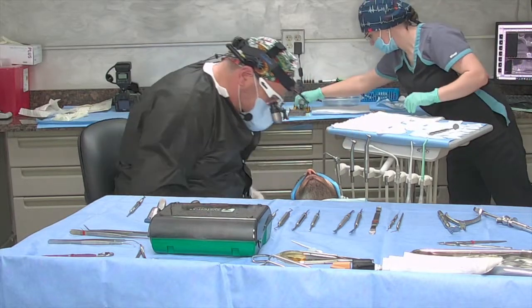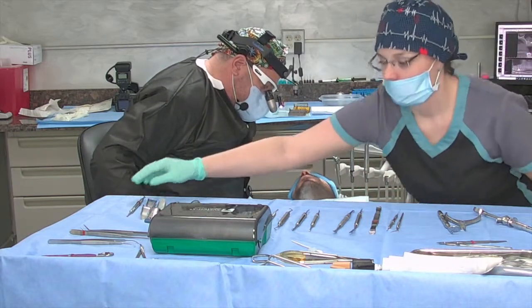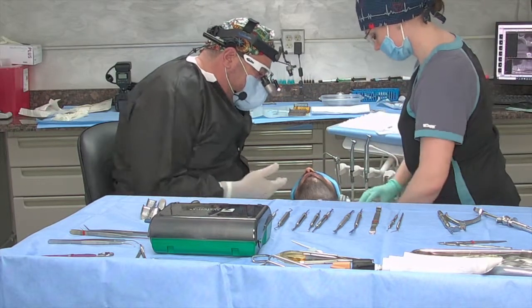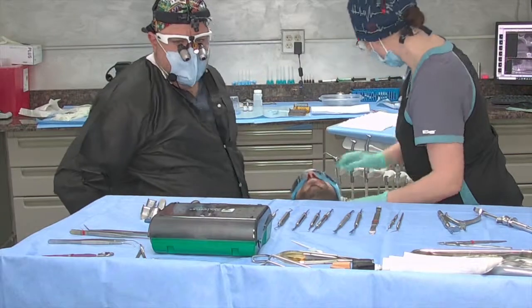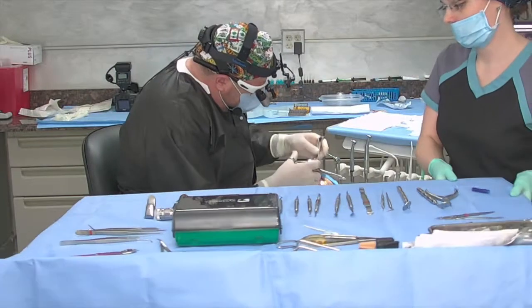So the hardest thing about today is I'm going to be bringing it as much as I can towards me. Right. Okay. So if your neck gets tight, just let me know. No, it's okay. Like this one? Yeah, and then how about my chin up? I've got a mirror that I could put in so they can see the angle. If I move you one way or the other, I'll tell you. Okay, let's give a little more, just to make sure that we're in good shape. Okay, we'll turn towards me, Matt.